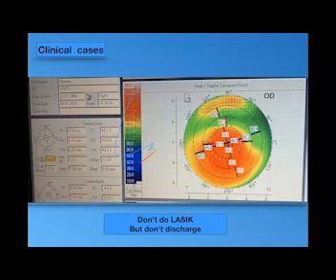It's not a matter of irregular cornea, but of non-understood corneal protrusion, because we used to see a corneal astigmatism. The corneal astigmatism in the topography is insignificant. So null. What will be corrected by the intracorneal rings?